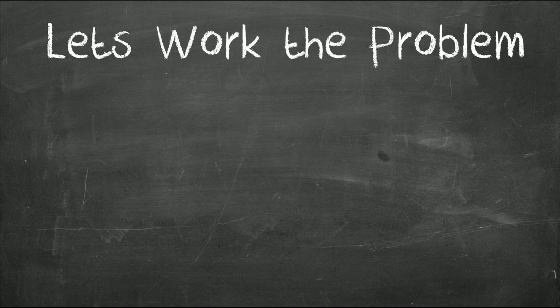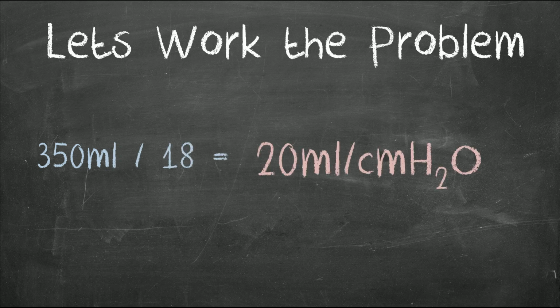So what we have is a tidal volume of 350 mils, and we now know that the inspiratory pressure, the plateau pressure, was 30 minus the Auto-PEEP, that's 18, and that equals 20 mils per centimeter of water. Now this is very low.